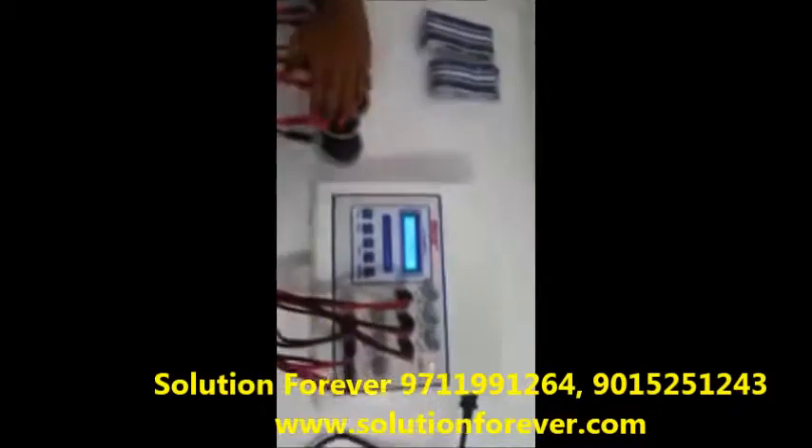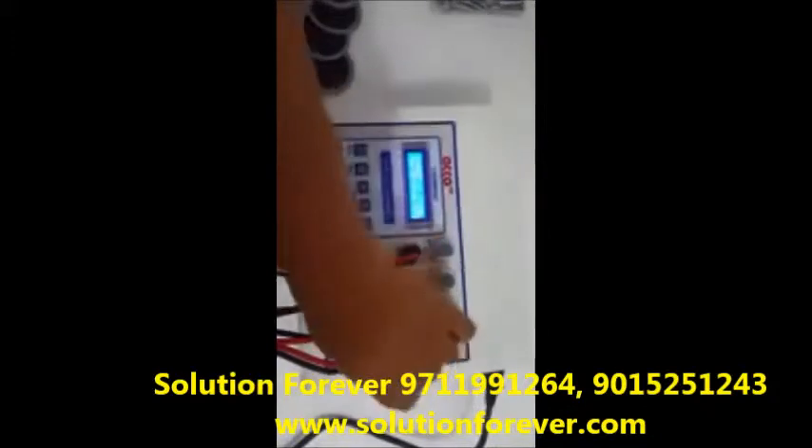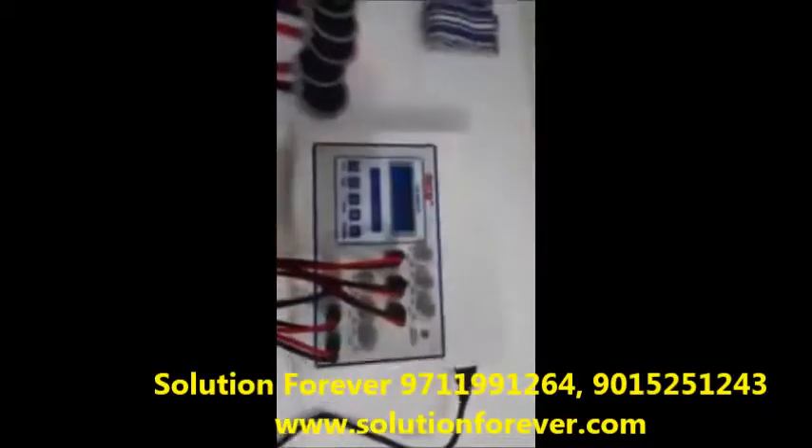After treatment is completed, make intensity knobs at 0. Now press the stop button. Switch off the machine. Demo is completed. Thank you.